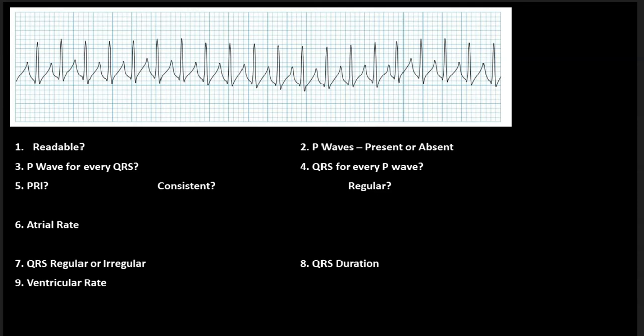Today we are going to look at SVTs, supraventricular tachycardias, and this is going to provide us not only a little overview of what we're looking for. In addition to that, we're also going to identify why this is supraventricular, and that there are at least 5 different rhythms that we would have to rule out before we can call something an SVT.